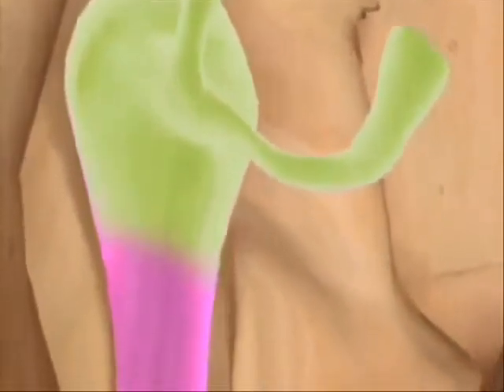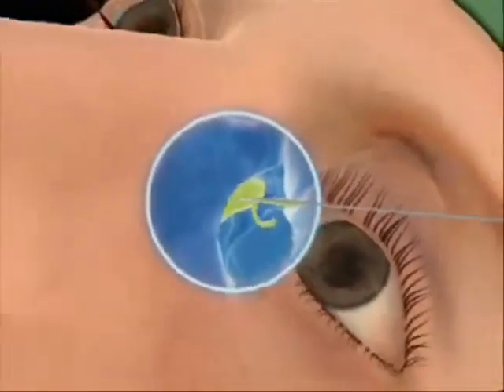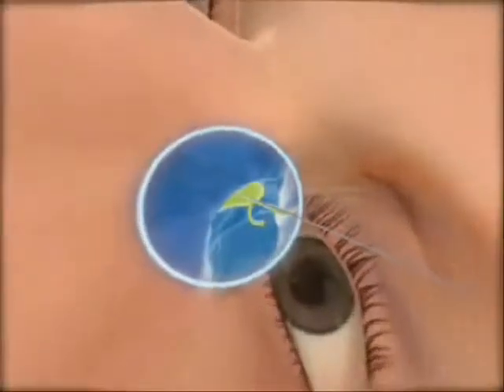Apart from these innovations, our line of research is currently looking at obtaining tissues that allow maximum absorption of the light energy delivered by the diode laser, thereby enhancing its action to allow shorter exposure times. The purpose of our work in the treatment of the lacrimal system is to identify techniques that are easier to perform and less harmful for the patient.